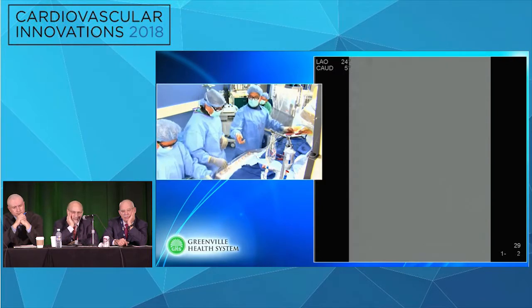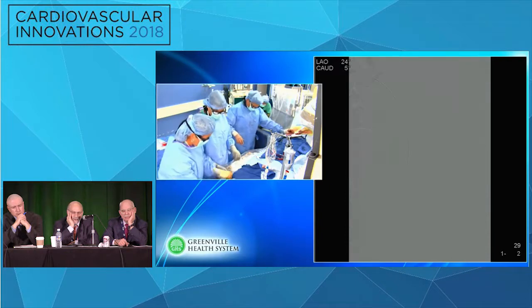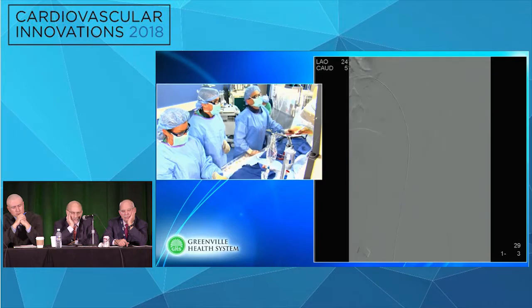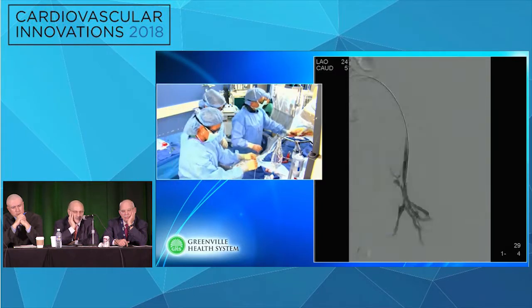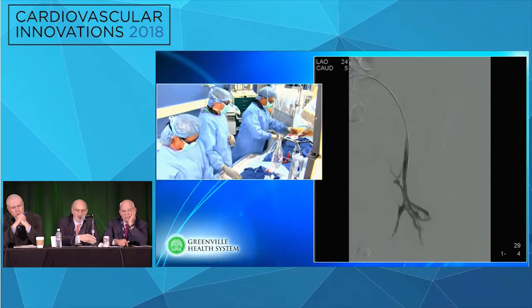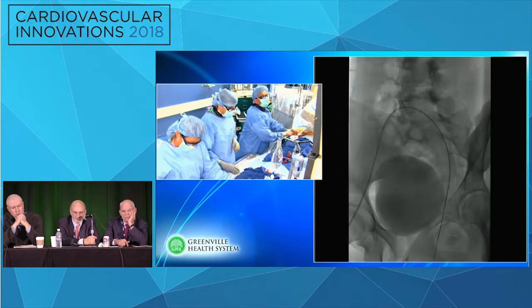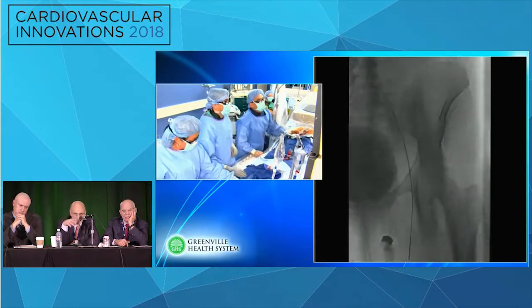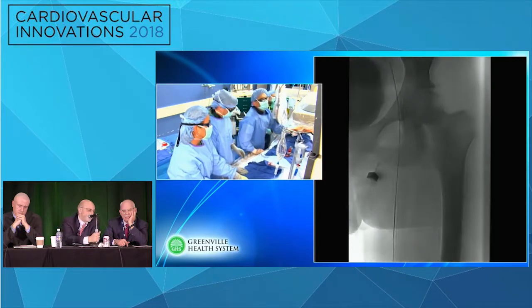The longest catheter, and then I would probably send from the mid-femoral head on up. And I'll tell you, we've had a couple of cases where we stented across this, it just turned out to be torture long-term. I mean, absolute torture. Restenosis in this area, and there's no good treatment for it. So, I don't know, I'm a little bit leery, but I think I'd redirect the wire at the common femoral towards the deep vein.